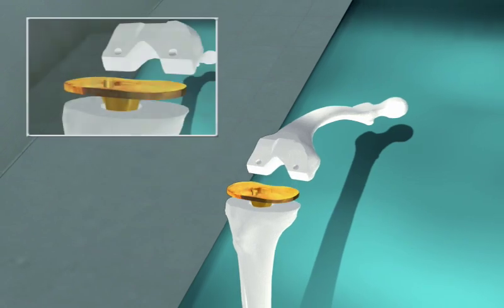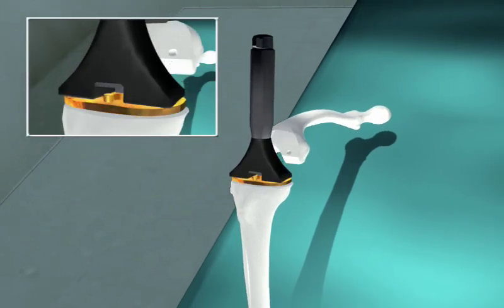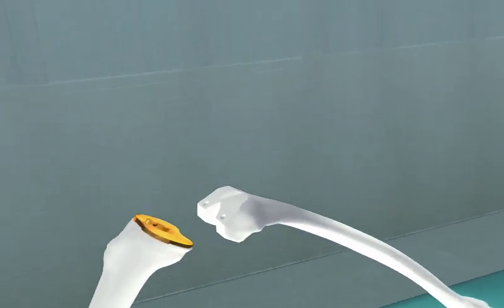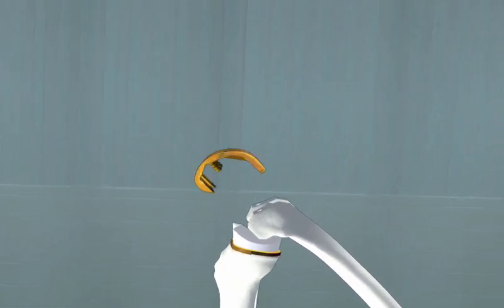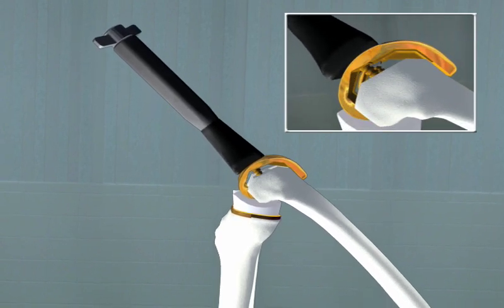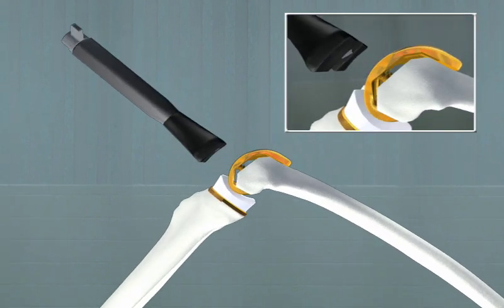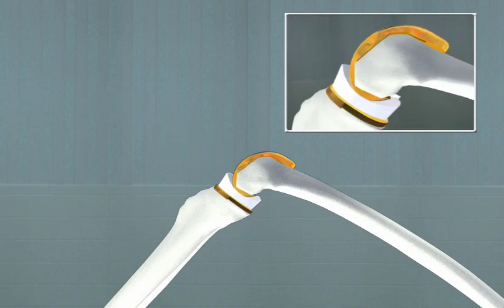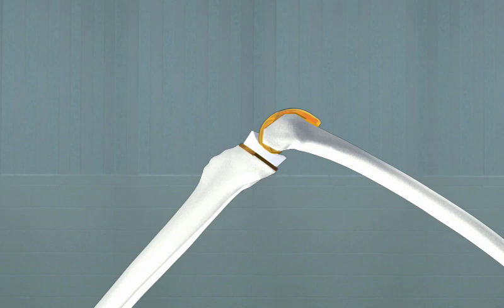Final component implantation proceeds with installing the rotating platform tibial component initially. This is impacted into place after proper cementation, followed by the rotating platform bearing, then followed by the cemented femoral component, which is attached to its holder impactor using a rotating motion on the handle, which then can be rotated to deliver final impaction with the knee flexed less than 90 degrees.